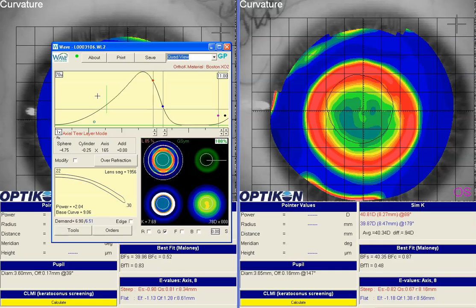For the left eye, we had added a little bit of topo demand to the lens and then reduced the sagittal depth of the lens a little bit, hopefully to bring the lens a little bit higher, but it still looks like it rides a little bit low. That said, I'm not sure centering this lens is going to solve all the patient's problems because it's fairly well centered. The patient might have pretty big pupils at nighttime and just getting into the entire treatment zone all the way around. So we want to make the treatment zone bigger.